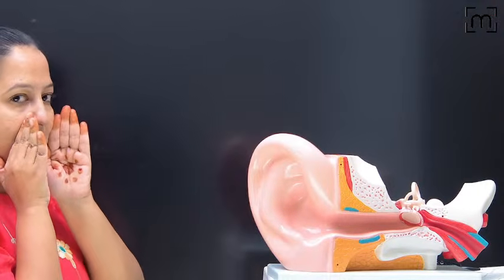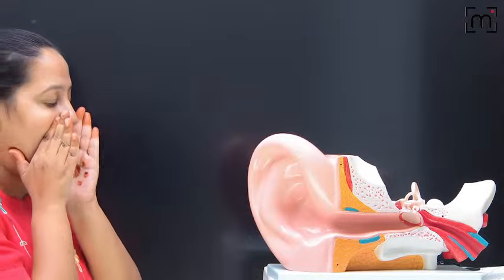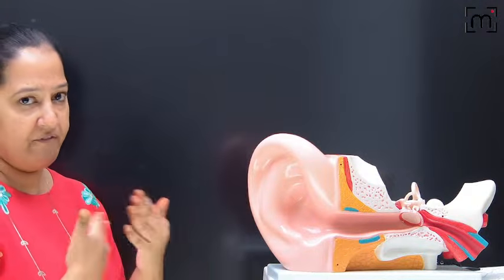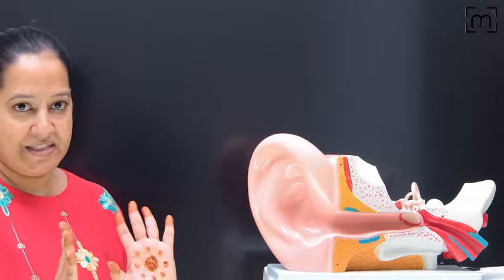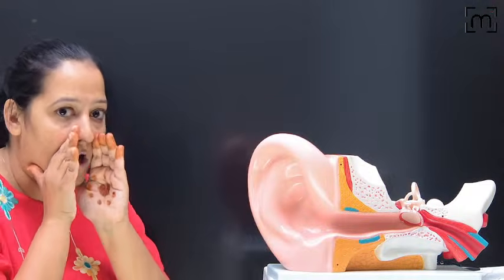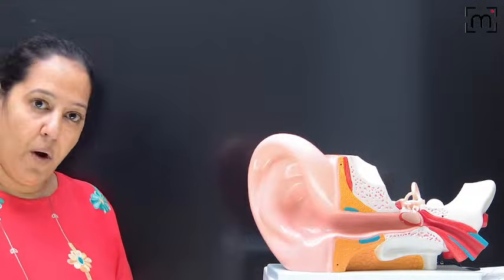Now I will start speaking the spondee words. Daydream, butterfly, football. Not shouting. Normal, as in conversation, with the same intensity I will talk. And I will whisper also. Daydream, football. Like that. So I will ask the patient whether they heard both or not.